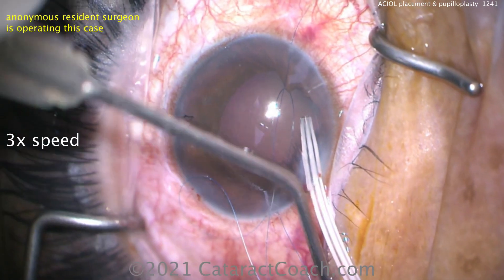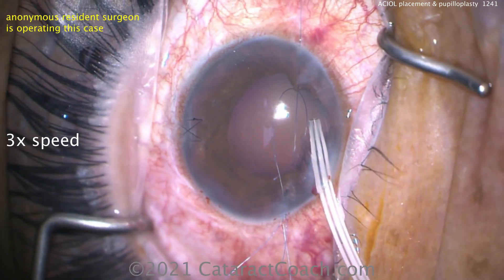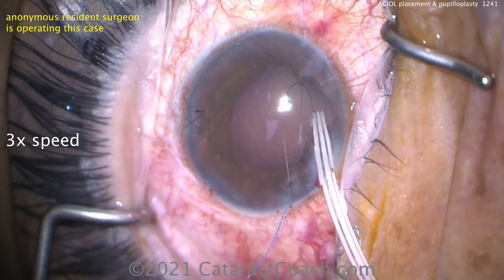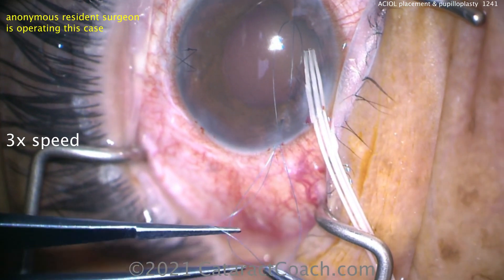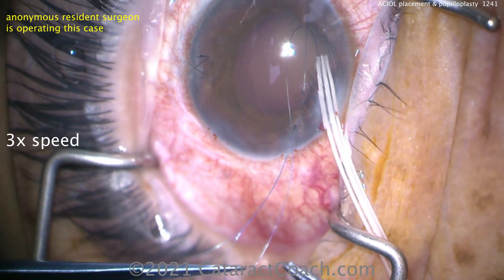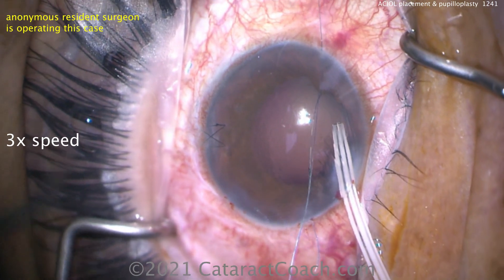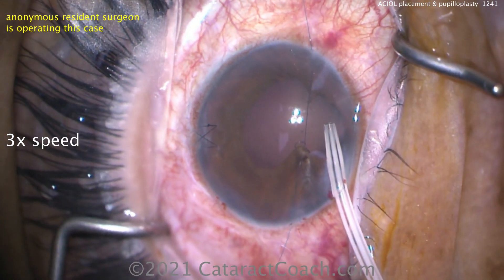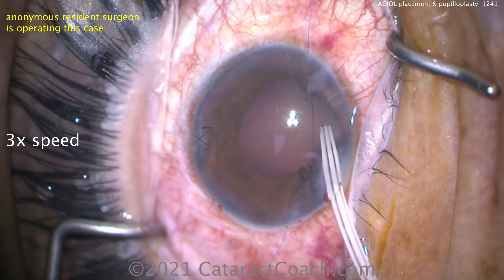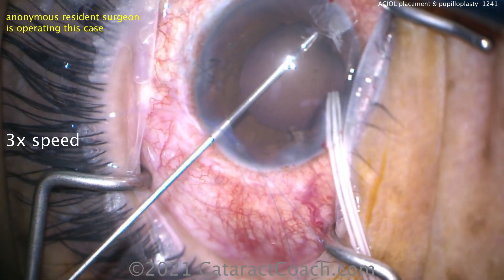Loop it through four times: one, two, three, four. Then we'll tighten this up. The suture's going to pop through — cheese wire — on that iris. Look at the top of the screen. That first bite of iris, as the suture's tied up, is not enough of a bite of the iris tissue. As it's being pulled — there it goes — it just snapped. Now what? You've got to start over. Get that old suture out and let's start over again.